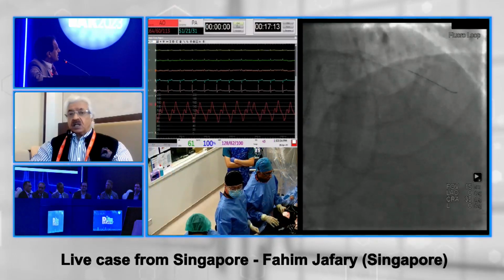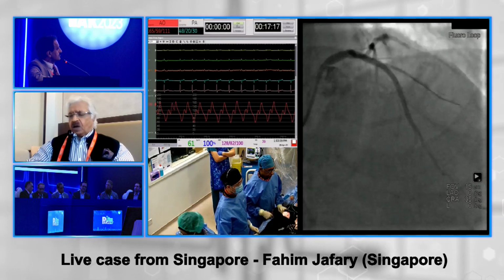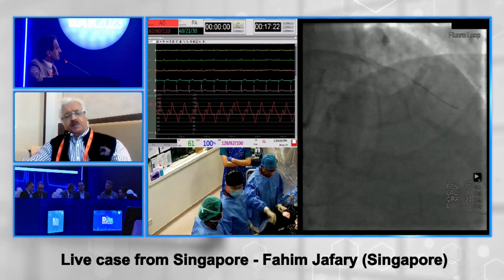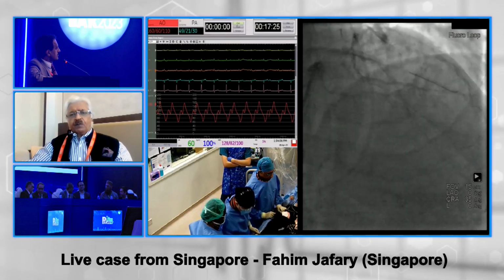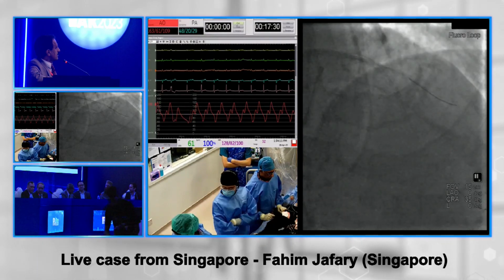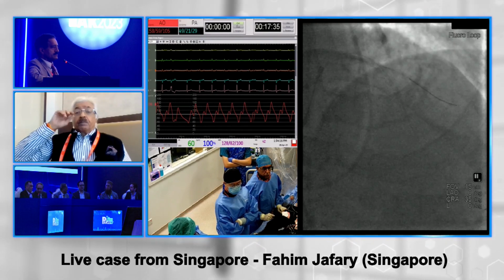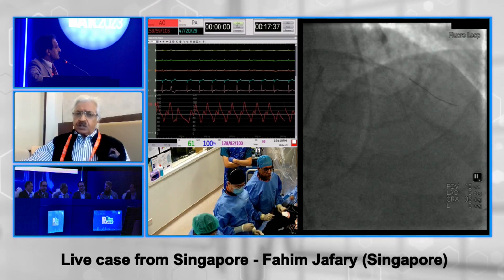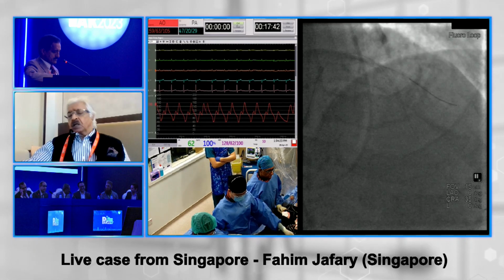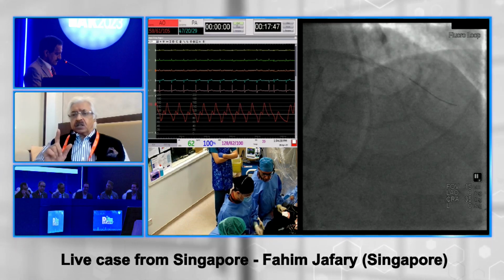But MSAs are very important, and I look at MSAs in a huge way. For me, IVUS has to be 5.5 and OCT has to be 4.5. But OCT measurements, I aim for 5, and IVUS measurements, I aim for 6. So I go even a bit higher than that for my MSAs for mid and proximal segments. I think you've got to look at least 5.5 on IVUS, 4.5 on OCT, and even get it bigger than that. Symmetry does not matter.